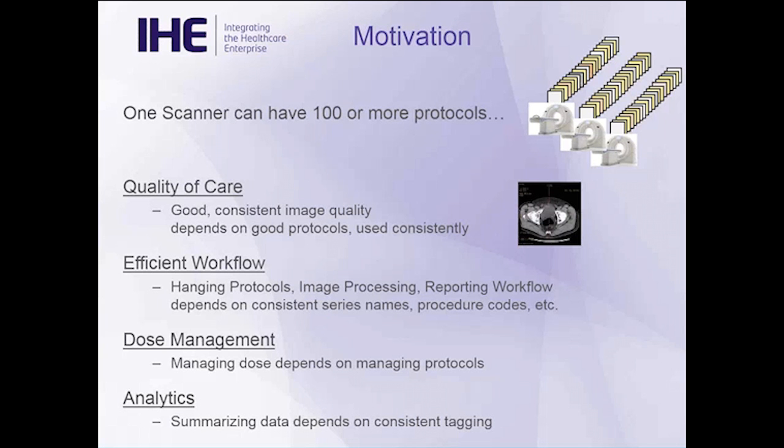The impact that has is, first off, on quality of care, that the way you produce consistent, good image quality is by carefully managing your protocols, setting the parameters appropriately for the features of the system, for the types of studies you do, for the types of patient demographics you're dealing with, patient sizes, et cetera, and making sure those are used consistently. And that's really difficult unless you've got a way to manage them.